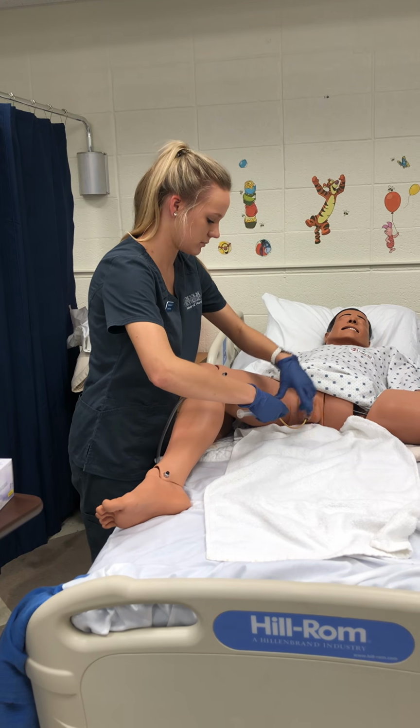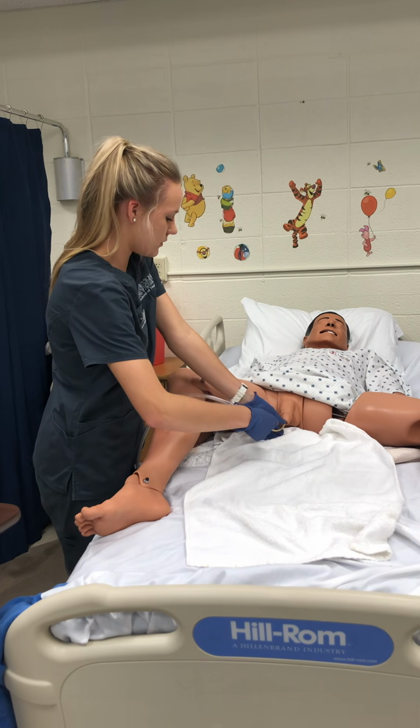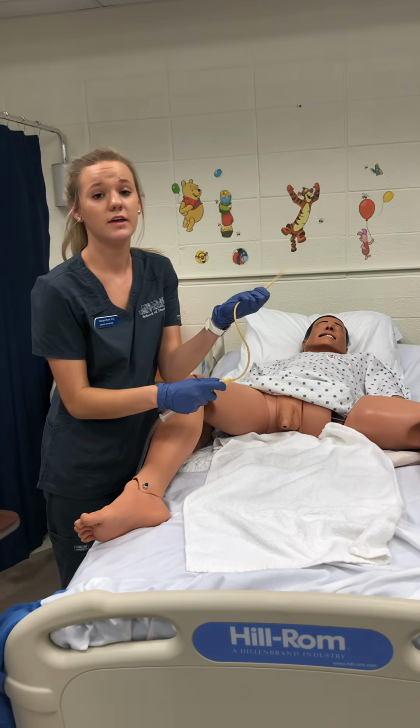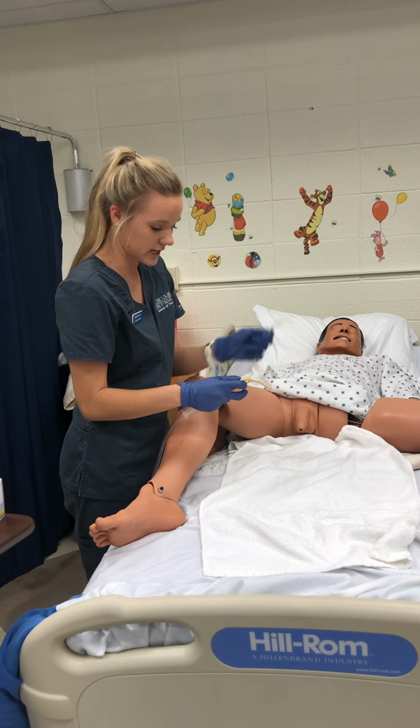Perfect. Okay, so now I'm going to go ahead. Mr. Jones, you're going to feel some pressure, okay, as I pull this out. I'm going to pull it out in one quick swoop. Okay, I'm going to examine the top of the catheter to make sure that the balloon is intact, that there aren't any pieces missing. It is intact, which is good.